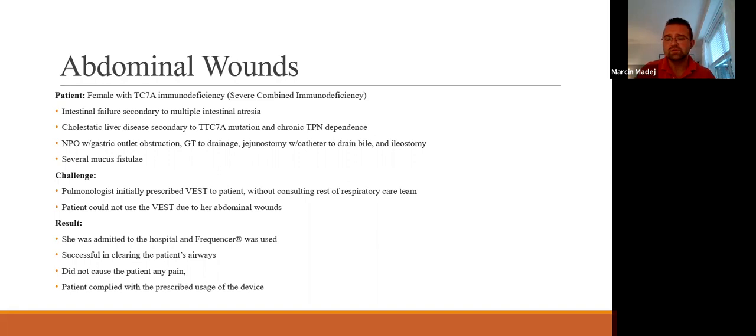And of course, during my initial evaluation, I discussed what are certain things that they perform at home for airway clearance. Have they ever performed a formal airway clearance? And mom told me that yes, she was prescribed a vest by the pulmonologist. But sadly, it sounded like there was no official discussion of other potential means or other airway clearance measures. She was just prescribed the vest, like, oh, you're having respiratory issues, let's just get the vest. But it seemed like not much was presented to her.